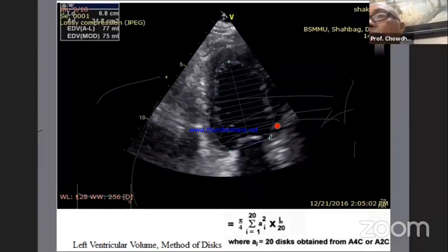And at times trabeculae are thought to be a part of the papillary muscle. That is why some people make the line on the inner side and some people on the outer side. But this strip of the myocardium will differentiate between the pericardium and the endocardium, so that we can exclude the trabeculae and we can well delineate the inner line. So these are the important things.